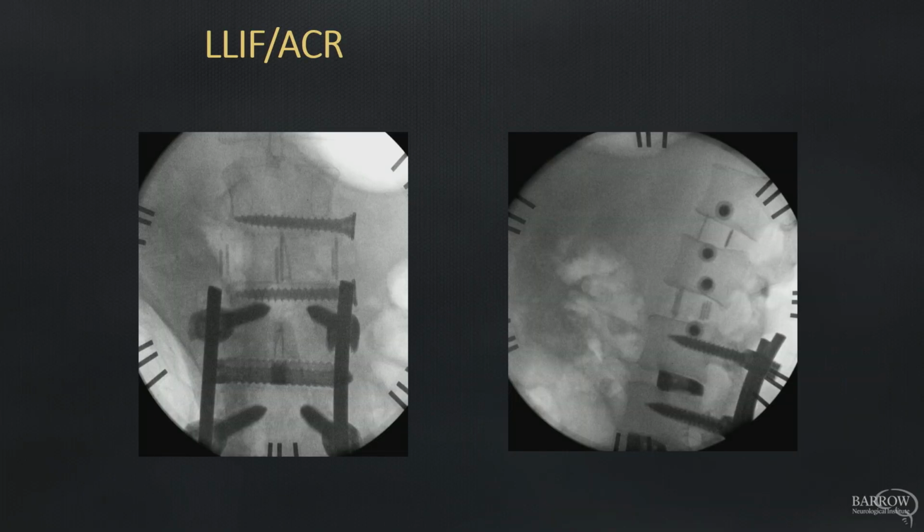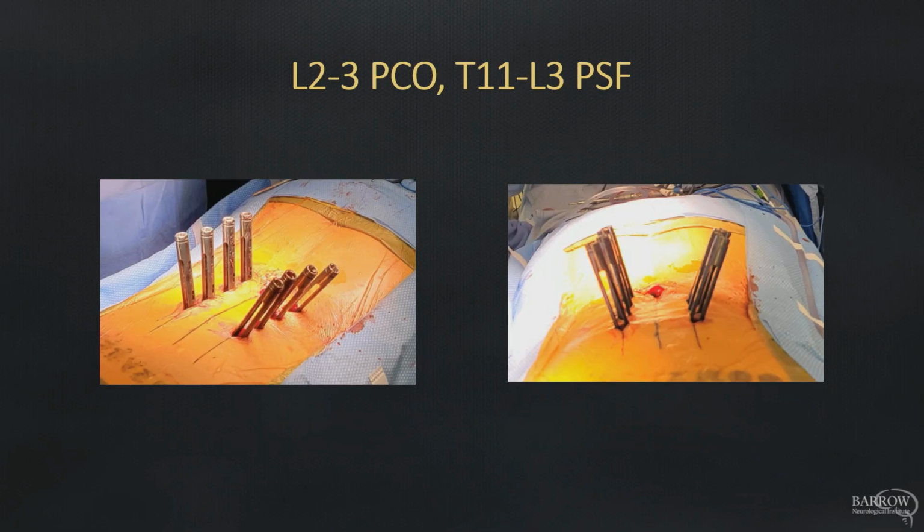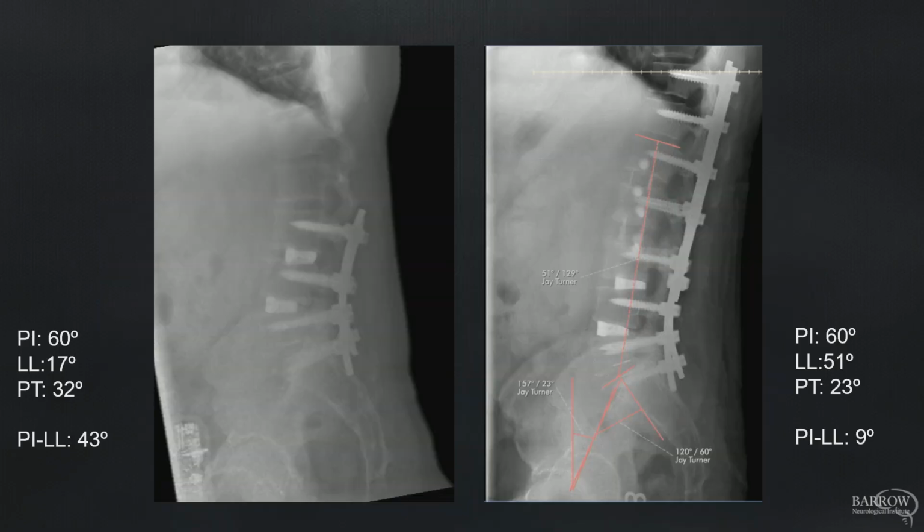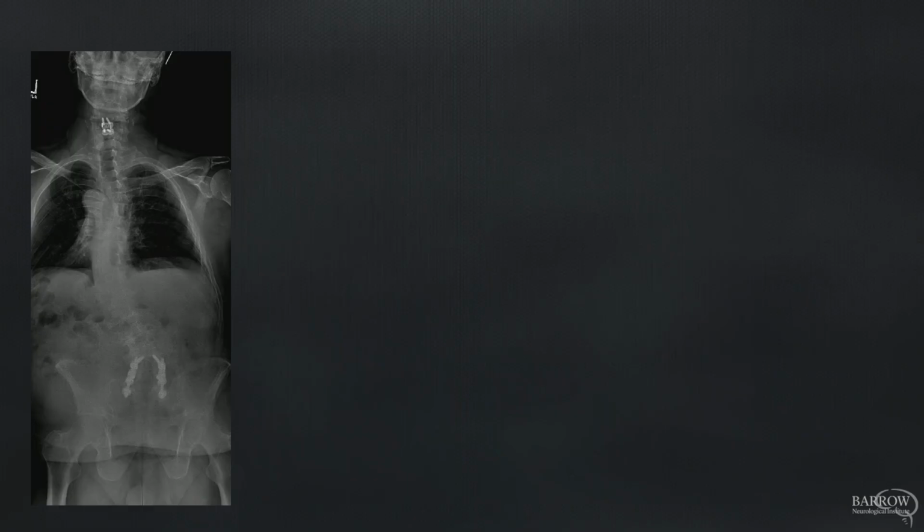This was one that was rigid intraoperatively and opted to cut the ligament and put some hyperlordotic cages in, not to get hyperlordotic correction here, but really just to neutralize those levels, and then locked it in from the back with percutaneous fixation and a small posterior column osteotomy at the bottom, and got a reasonable realignment and restoration of more physiological alignment across those segments.